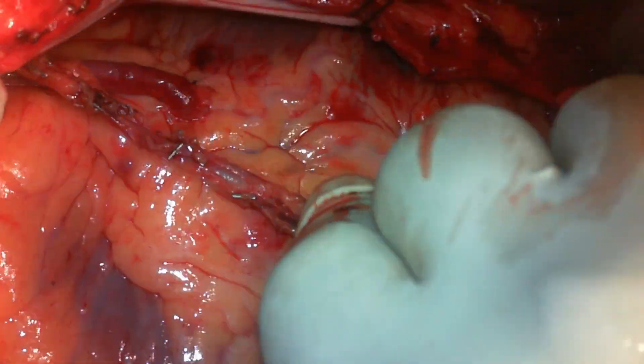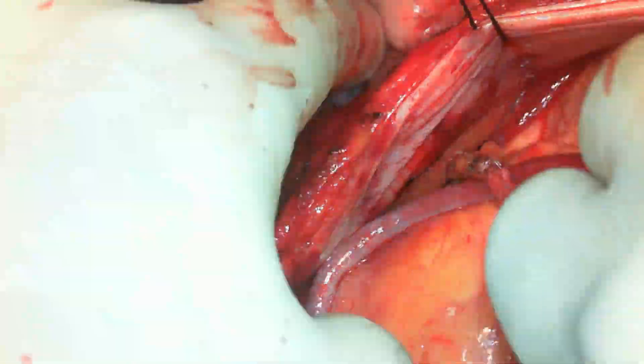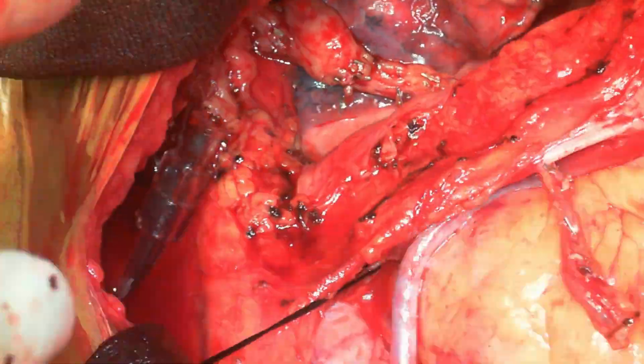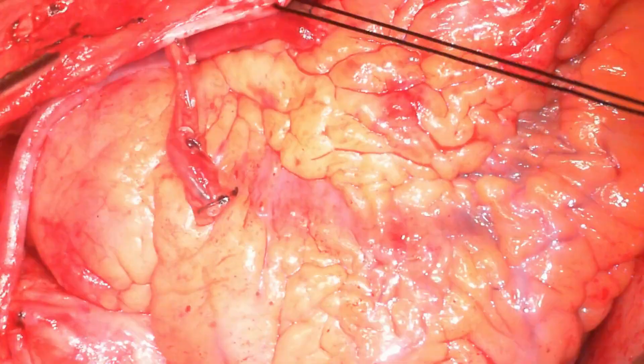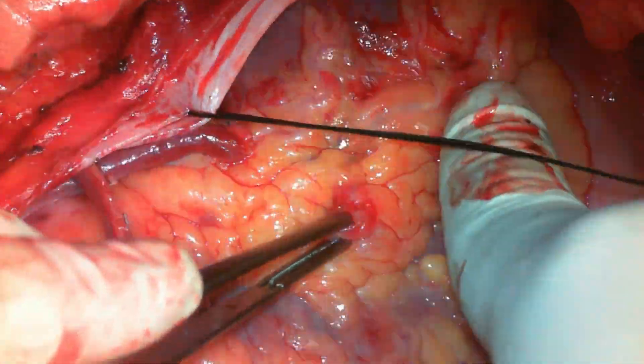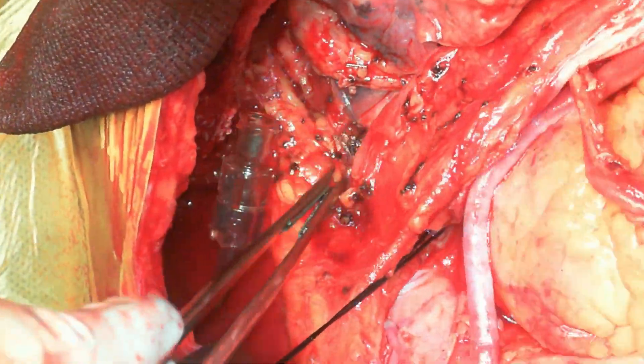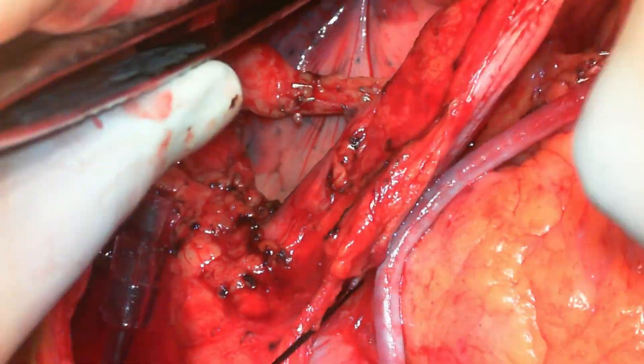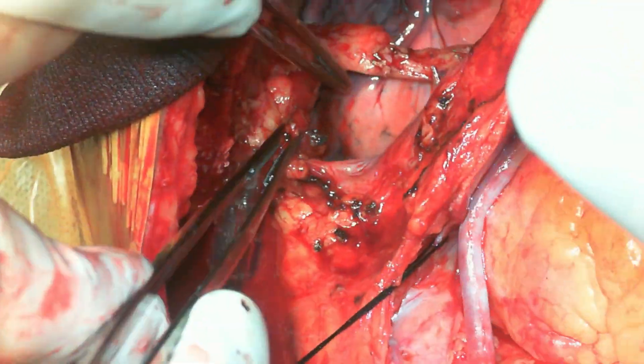If you find the mammary is stretched after grafting to the LAD and the lung is pushing the internal mammary artery — especially when the heart is more medially placed — one can fix the lung to the lateral chest wall. As you can see here, the IMA is coursing over the left apical lobe, though there is another inch of mammary yet to be harvested.